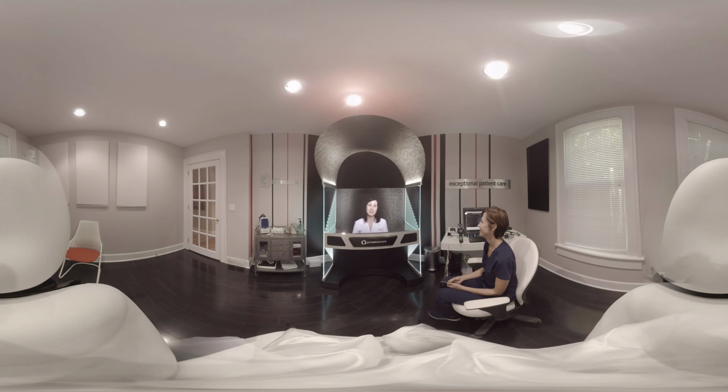Nurses are trained in advanced physical assessment, so they can act as the provider's hands in the room with the patient. As the provider, I'm able to direct the exam in real time from wherever I'm located by dictating to the nurse any maneuvers that I need her to perform in order to get findings on a patient. Of course, if I need to see any finer detail in a patient, we have a variety of cameras that we can use to make sure that I'm getting the information I need to make a high-level clinical diagnosis.